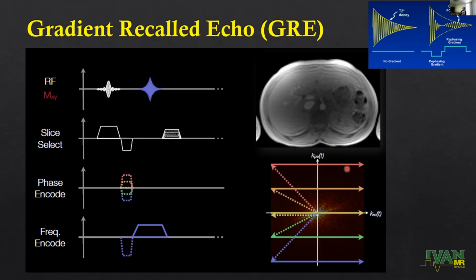So it's basically like going from your FID to spectra. Here we are going from K-space to the spatial domain, which is the image.